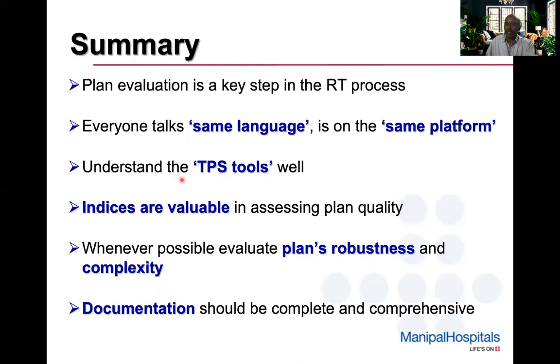You have to understand the TPS tools well, and there are many indices. They are all very valuable in assessing plan quality, but do get to know the limitations of the indices you are using. And whenever possible, evaluate the plan's robustness and complexity.